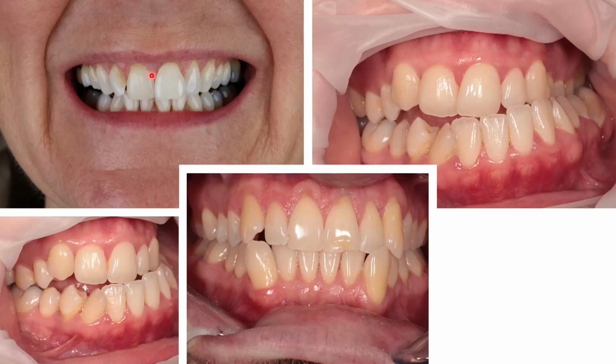The case in the middle then is obviously severely crowded in the lower arch. We've got some cross bites. The canines are both lying in a very unfavourable direction for anything. You can see the roots coming down this direction here and this direction here.